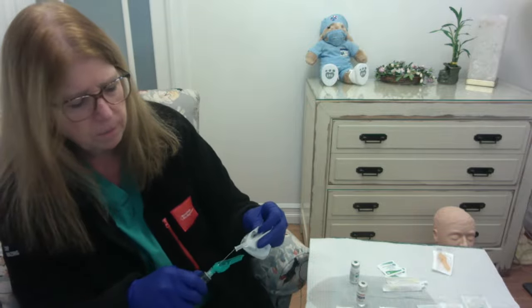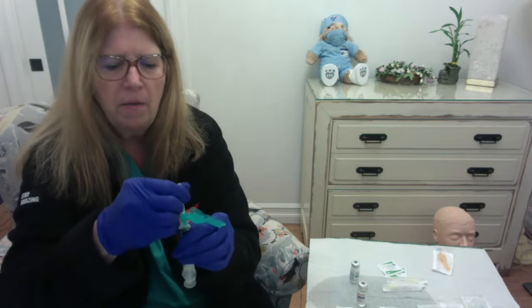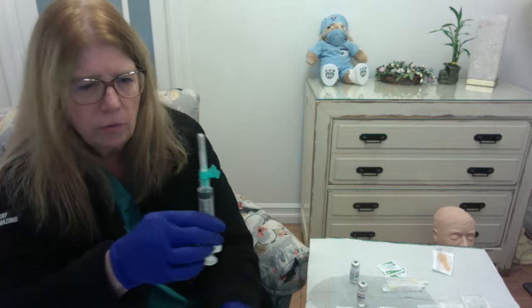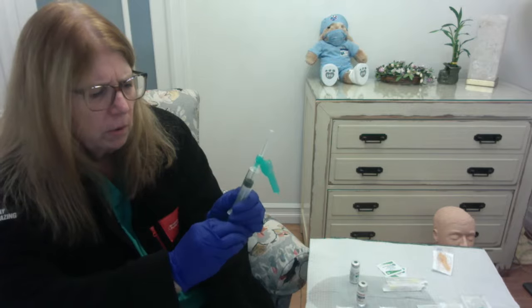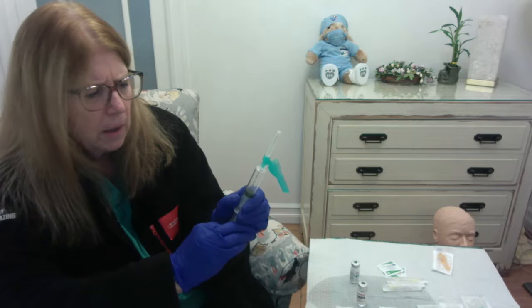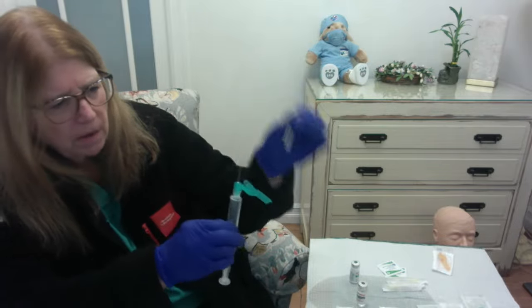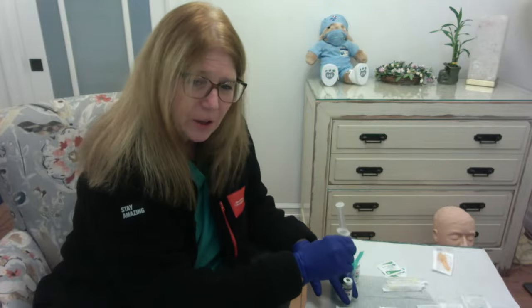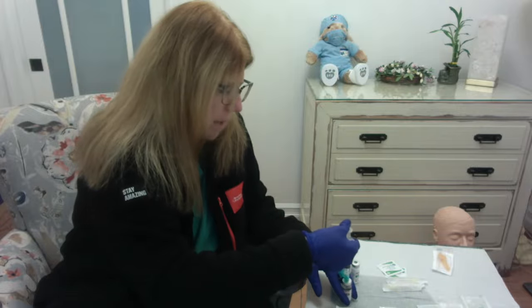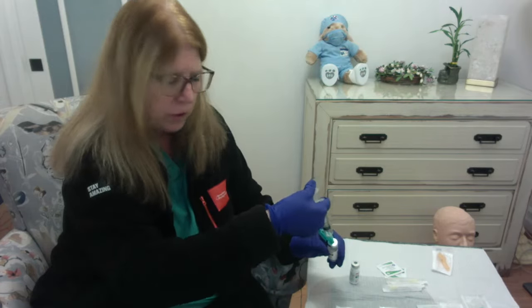And my cap came off. Let me get this out of the package. Okay. So I have my needle onto my syringe. So first step, I have to put 7.5 milliliters, right? So let me bring this back and get it to where I need it to be with my air. I'm going to take off my cap and I'm going to put this air into the diluent vial. I'm going to inject it right in there, and you might find some resistance, especially when you're trying to put a lot of air in there. Hold that plunger, okay, with that resistance.